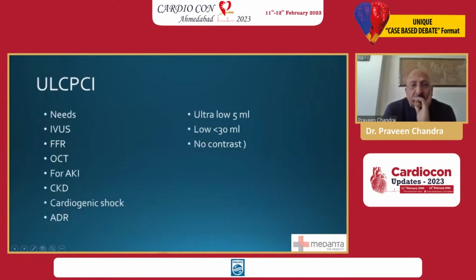So what ULC PCI means is that it is ultra low contrast, or low contrast, or no contrast, and you need IVUS, FFR, OCT. And those patients who have kidney injury, acute or chronic, cardiogenic shock, ADR, all these patients can now be effectively treated by using minimal contrast.